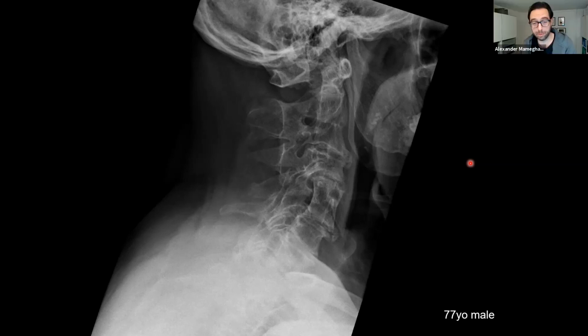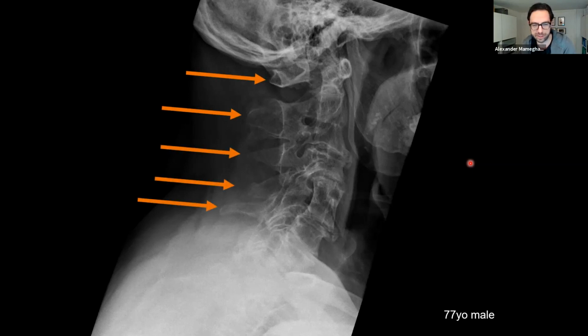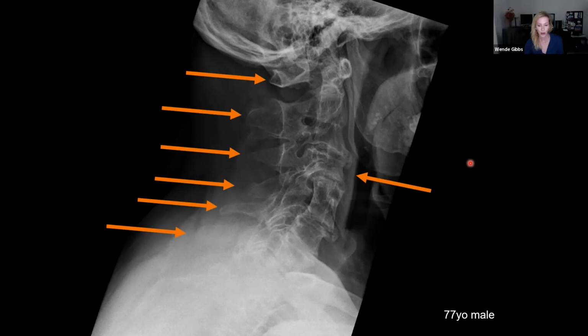Yeah, and the most difficult part is the counting. You say C2-3 is fused, it's ankylosed, it's congenital. If you see the spinous process and have a look, what level would this be? Which vertebra would this be? I'm going to guess 4. It's 4. Yeah, I agree, but the radiologist first said 3. So it's typical. You have to look very carefully.